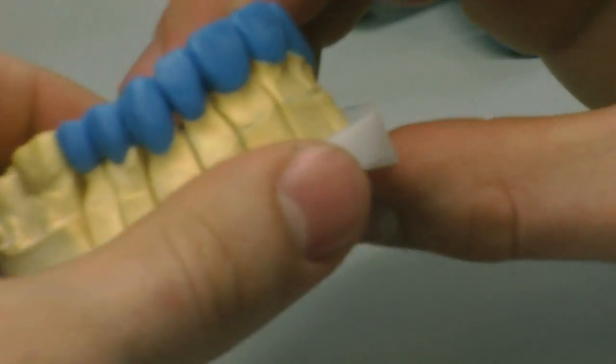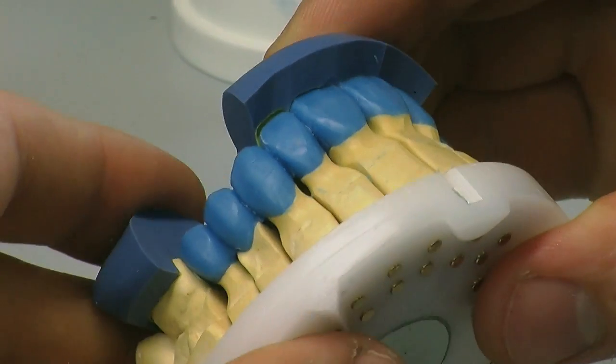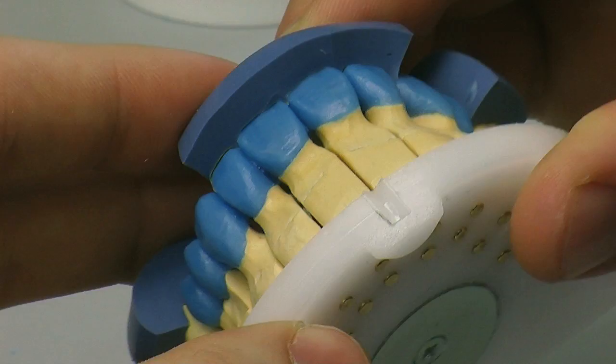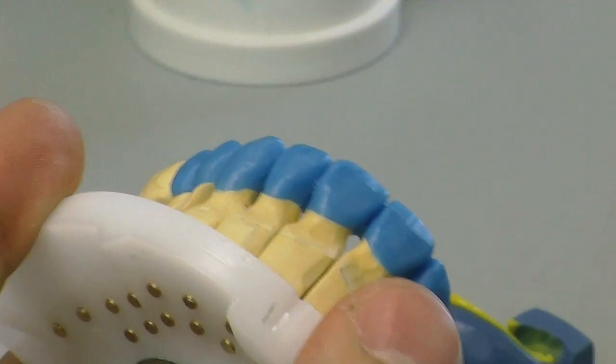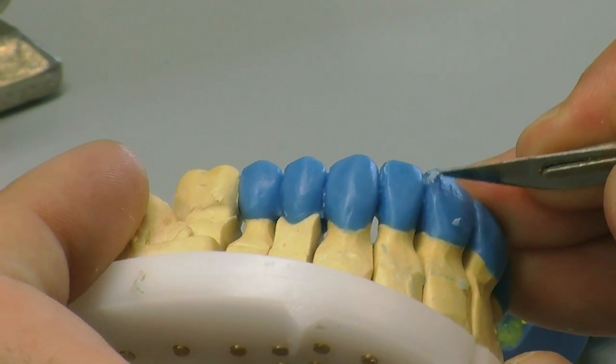So what we're going to be doing now is using the cut down putty again, and we're going to be placing it on the model, and now we're going to do our reduction for our incisal build up and our porcelain application. This is a technique basically where you have a 60 or 70% substructure, which gives you the strength of the material. Talking of the material, in this case we're going to be using Emax.